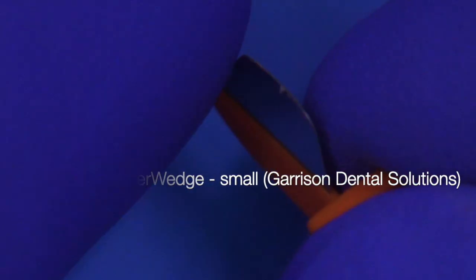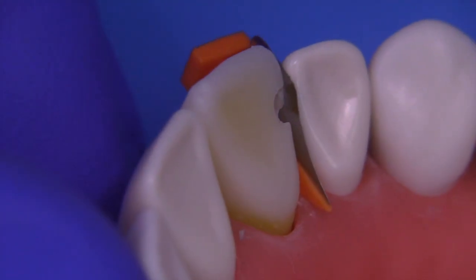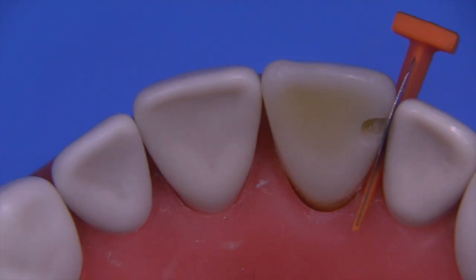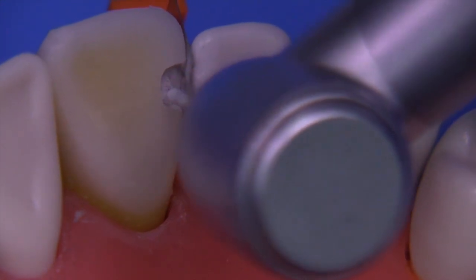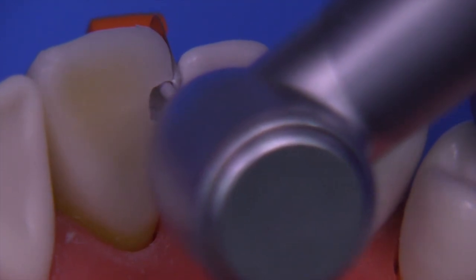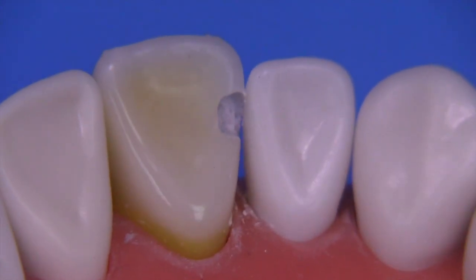I'm going to use a Fender wedge small, made by Garrison Dental Solutions. You could also use a matrix band held in with a wedge, or just a matrix band alone — this will create some separation in the teeth and really protect you from nicking the lateral incisor. Let's not do at least three things: don't nick adjacent teeth, don't ever leave decay behind — the dark or soft material in areas you may not be used to seeing — and definitely don't leave any undermined enamel. Make sure all enamel is at 90 degrees or flared so it's not undermined. The wedge will take the brunt of any damage.